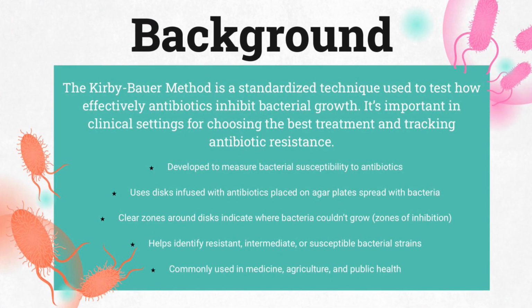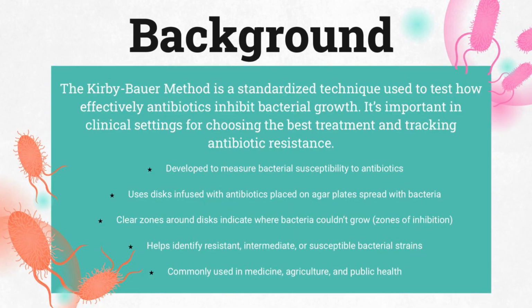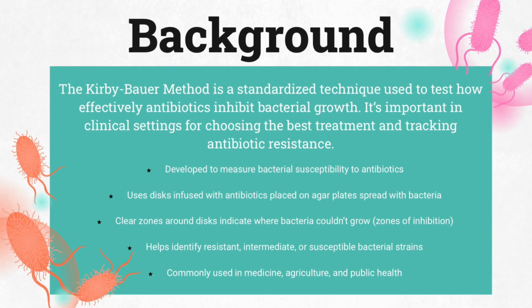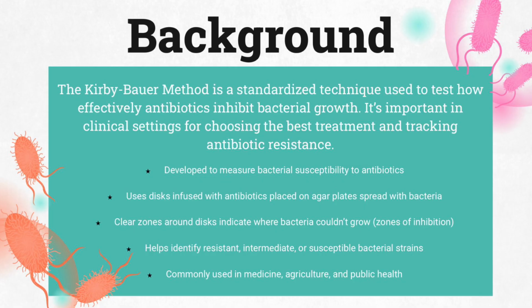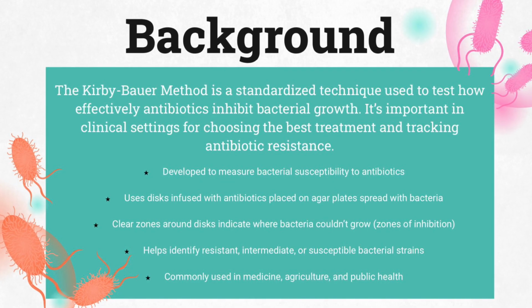So what exactly is the Kirby-Bauer method? It's a standardized procedure that tests how well antibiotics inhibit bacterial growth. This method is crucial in the clinical setting as it helps doctors choose the right treatment for infections and tracks resistant trends. And here's how it works.